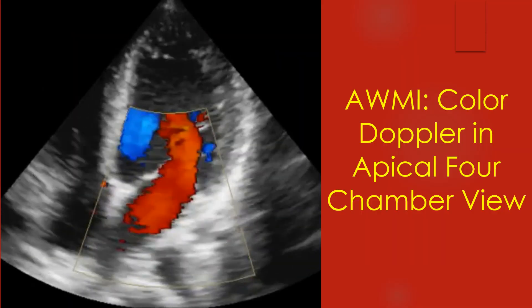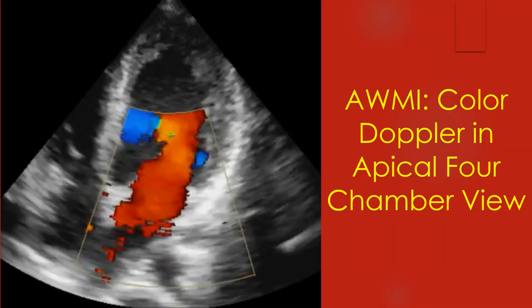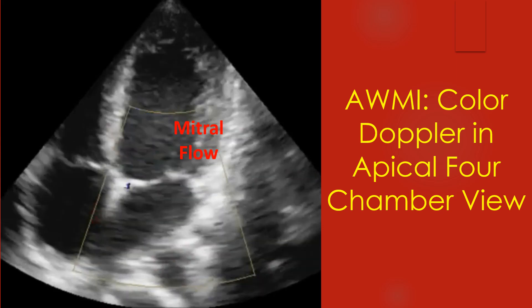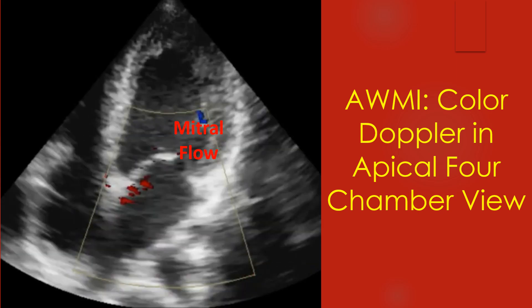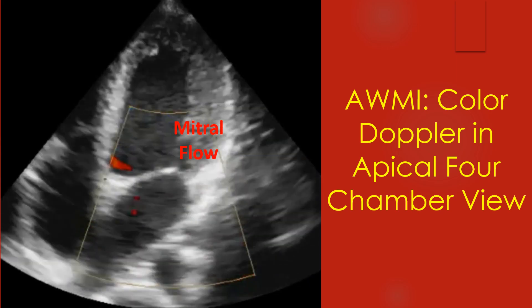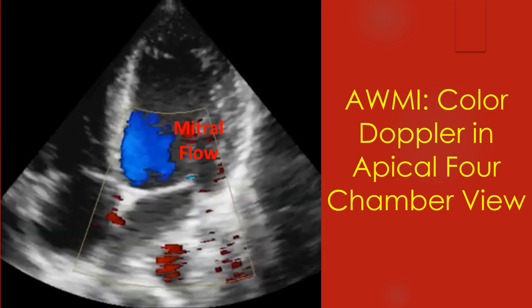Color Doppler imaging in apical four chamber view. The red flow is diastolic mitral flow towards the transducer, and the blue flow is away from the transducer towards the left ventricular outflow tract.